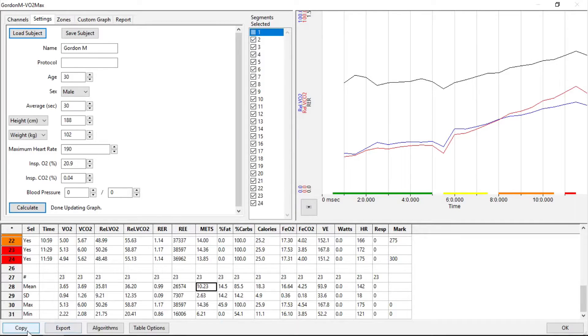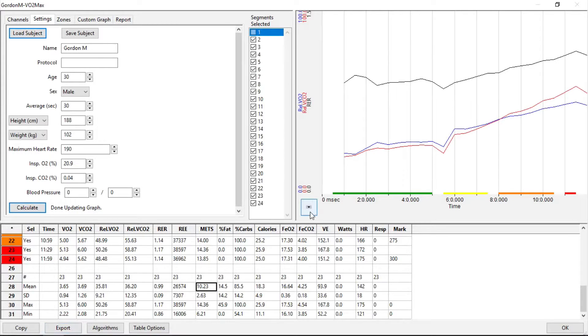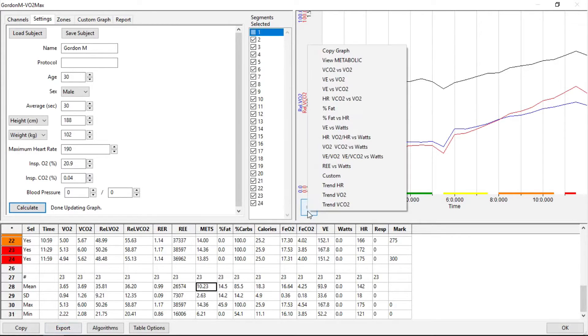We can copy all the data. We can export it out as an Excel file. We have a choice of numbers of graphs that we can copy and put into a report.